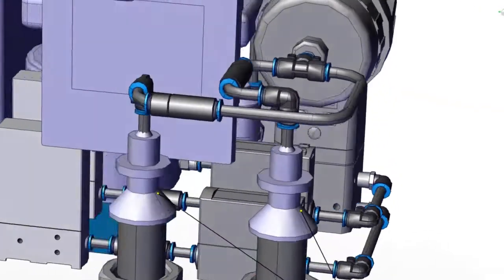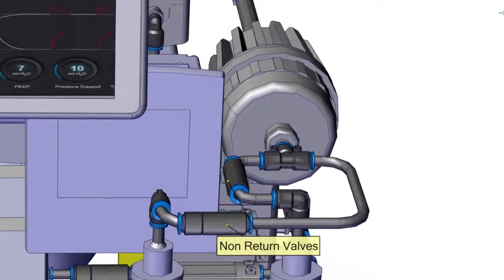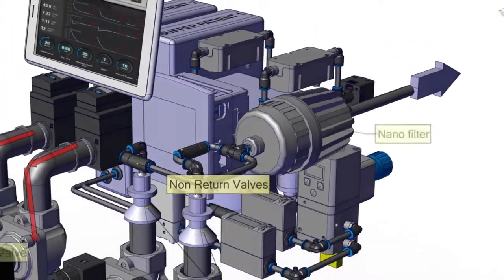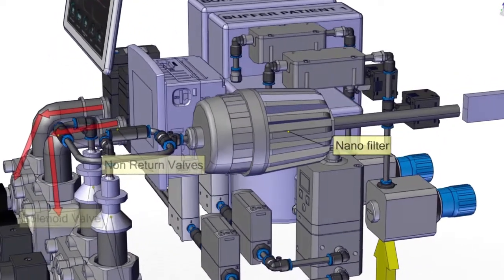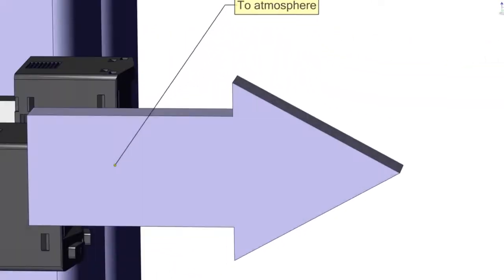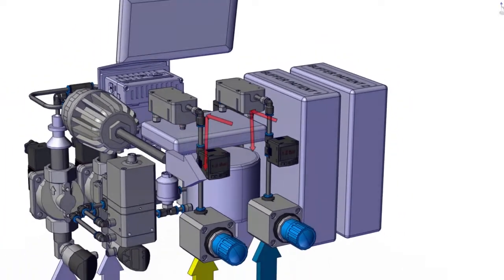The system we propose is fully pneumatic. The frequency at which it can work is 20 milliseconds, so the respiratory rate control is between 10 to 30 BPM. The system is completely automatic. The adjustment of the inspiratory-expiratory ratio between 1:1 and 1:4 is done using a PLC. The equipment can operate in CMV mode, in PRVC mode, or in VCV mode.